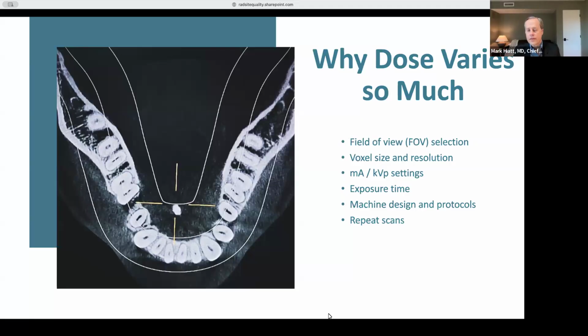So your philosophy may be that of trying to do it as low as reasonably achievable. That's correct. Now, a final follow-up question. In placing that shield, do you also try to have it high up to protect the thyroid gland? Yes, that is the biggest concern. If I read anything in the literature, however low the radiation is, the biggest impacted areas would be the pituitary, I mean the salivary gland, thyroid, and maybe the breast area.